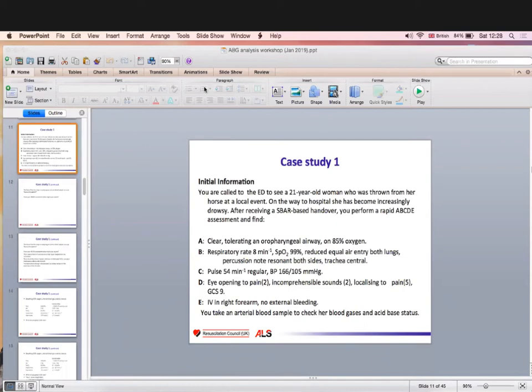Lactate high. Why? Because of injuries. The patient doesn't have other injuries, only head injury. Then lactate can be normal, right? If there is no other injuries, then it should be normal. But if the oxygenation is poor due to the head injury, then lactate should be high, isn't it? But he's maintaining adequate blood pressure and saturation right now.